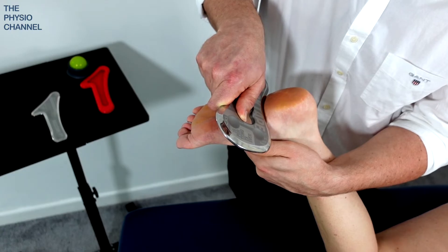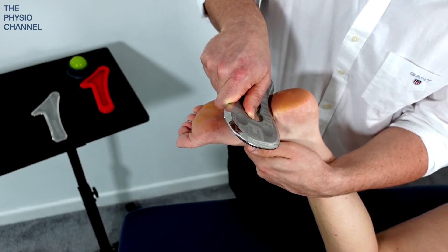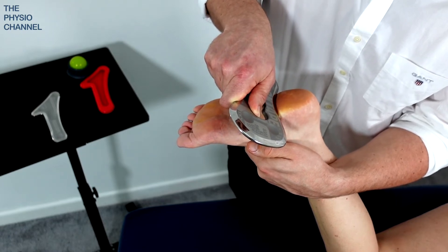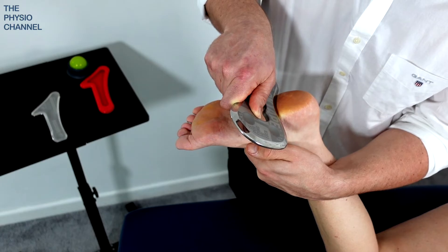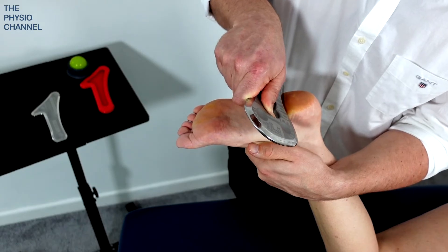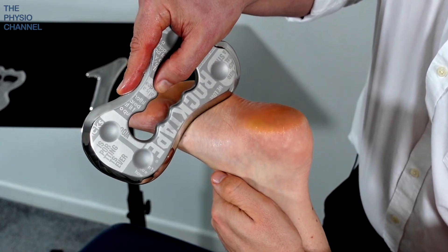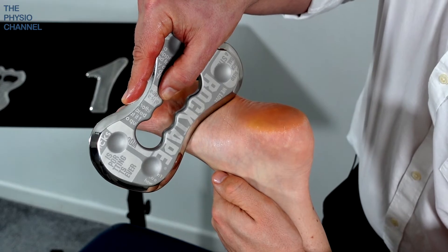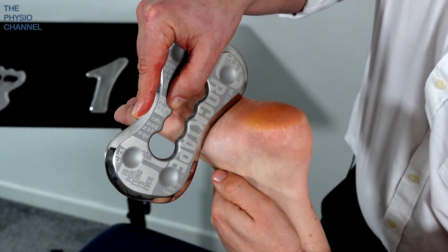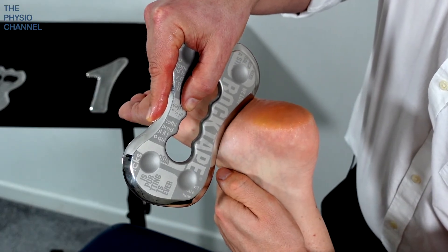As I come up towards the heel here, just lighten the pressure to make sure I'm not going to ride over any bony lumps like a heel spur, for example, which would be unnecessarily uncomfortable for the patient. The second repetition through the foot is going to have more of a medial bias, coming down through that medial arch of the foot again, making sure that we maintain that nice slow speed.